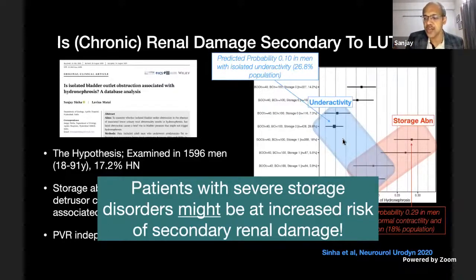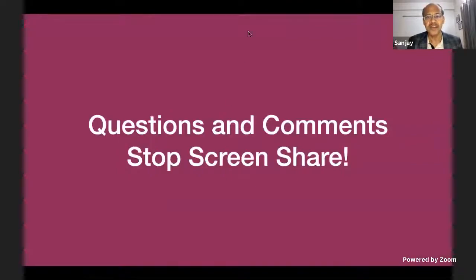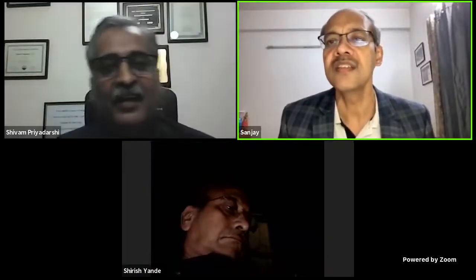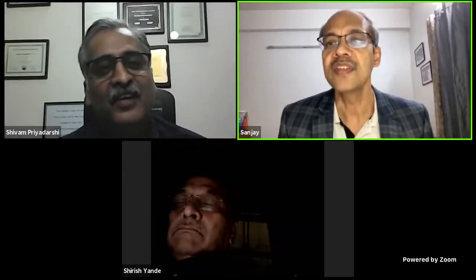If you find bad storage in any patient in whom you do urodynamics, it is very important to counsel these patients that if they don't follow up very carefully, you might end up with renal deterioration. So you can use this to mathematically predict which are the patients who are actually going to develop trouble in the long run. So with that, I will stop sharing my screen.